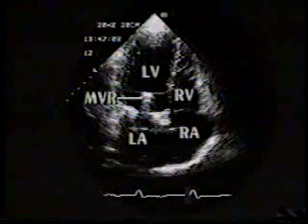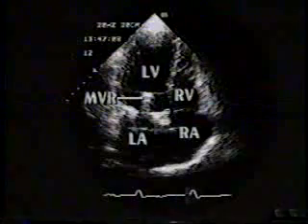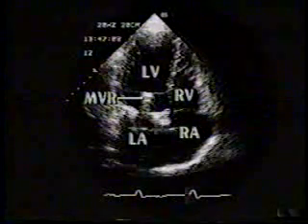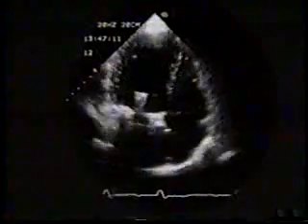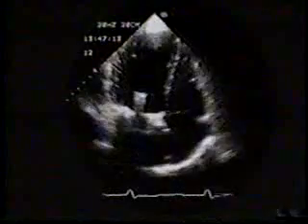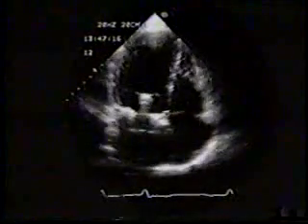This 80-year-old male also has a Starr-Edwards mitral prosthesis. On auscultation, mitral regurgitation was suspected. The left ventricle is mildly enlarged and function is severely reduced. In this case, neither scans in the plane of the poppet nor scans at the level of the sewing ring demonstrated regurgitation. You will notice that with an apical transducer location, the ultrasound beam has to pass through the mechanical prosthesis before it can interrogate the left atrium for regurgitation.